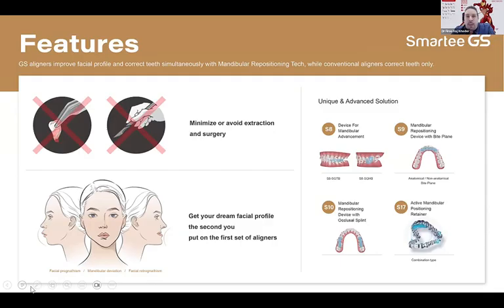So we have the S8, as we spoke before, for the SGTB and the SGHB, and the S9, the S10, the S17. The combination of those can result in a better profile for your patients.